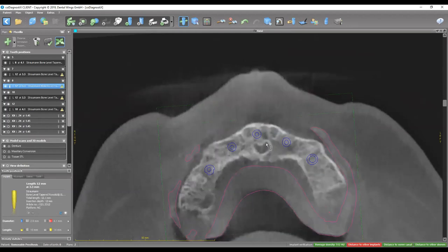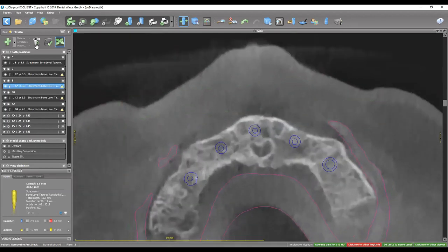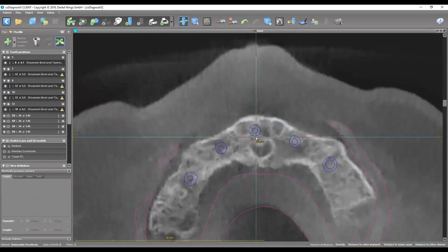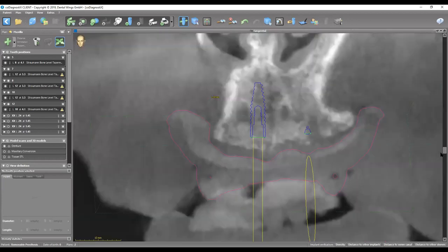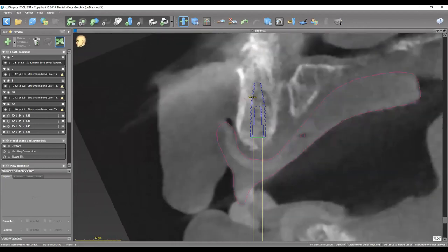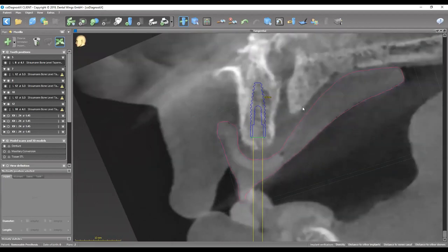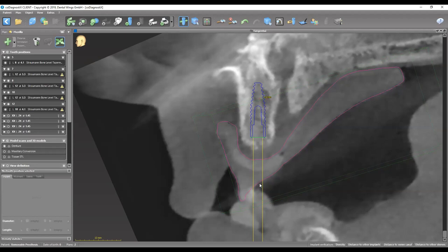Here it is — this is where the nasopalatine is. We're going to try to maintain 1.5 millimeters or more away from the nasopalatine. It looks like we've got 1.7 millimeters, which is good enough. The distance away from the facial plate is even more than two millimeters — everything looks good in terms of distance. Looking at the cross section, that's a 3.3 by 12 — good bone support, more than enough distance from both buccal and lingual plates. The center of the implant is emerging more or less to the center of the intaglio where the acrylic is bulk enough to accommodate the housing, which needs around four millimeters.